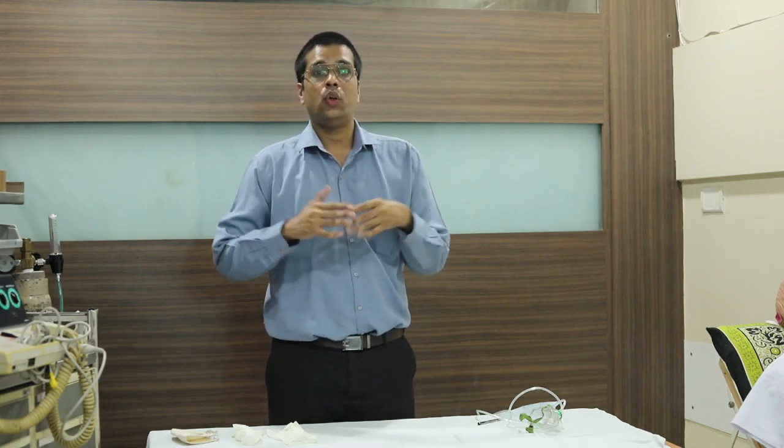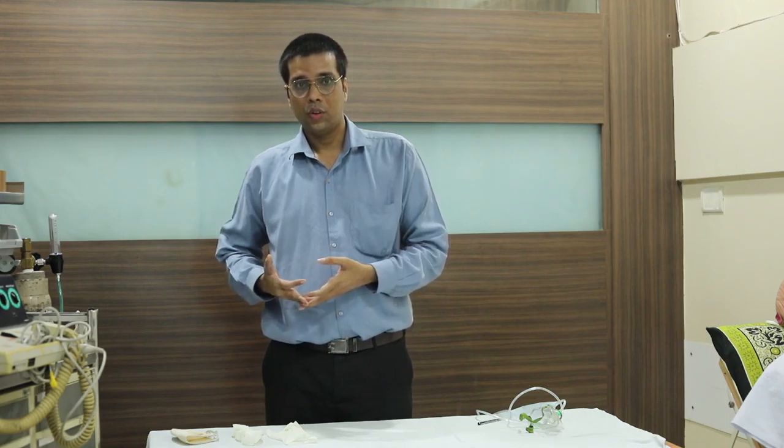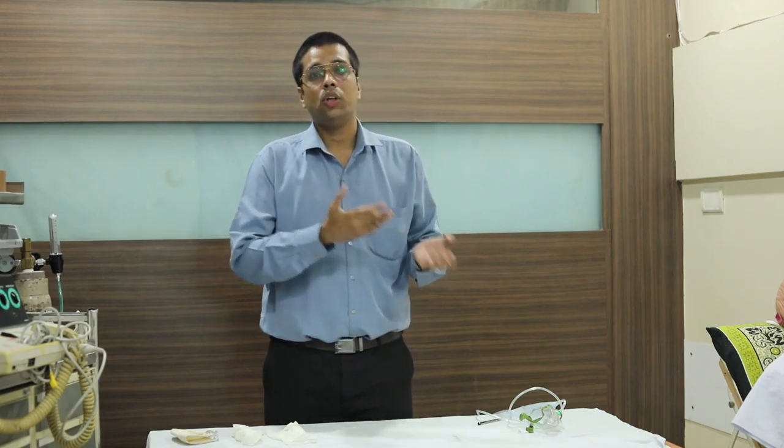This is the procedure. For any procedure, you want to make your patient understand what procedure you are going through. So I introduce myself and take the consent of the patient. After that, we move towards the next step.